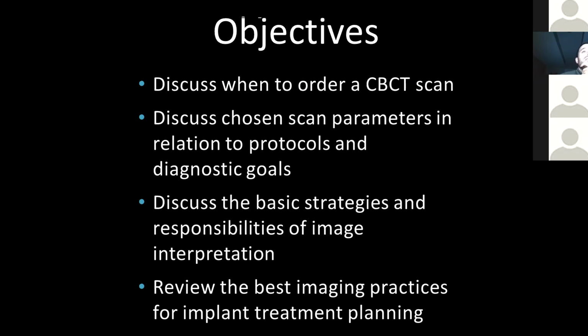On that note, if you have the scan data and a software that won't do it, you can many times move that data to another software which will do it. I have no affiliations or financial relationships with any software companies, but I'll share that our orthodontic clinic at the university uses Dolphin imaging, and they reconstruct their lateral cephs with that.